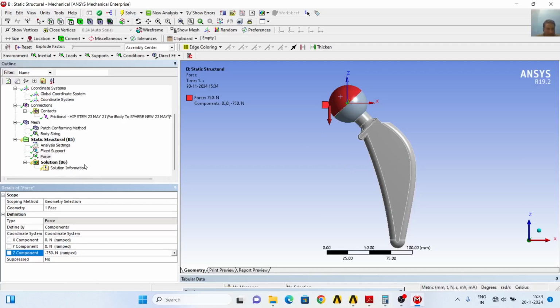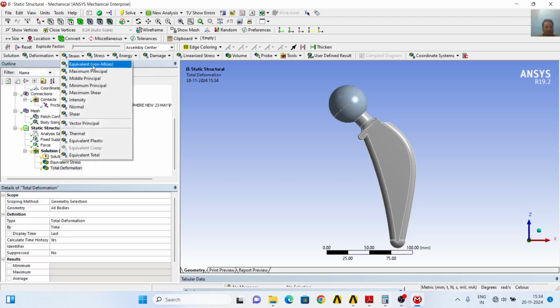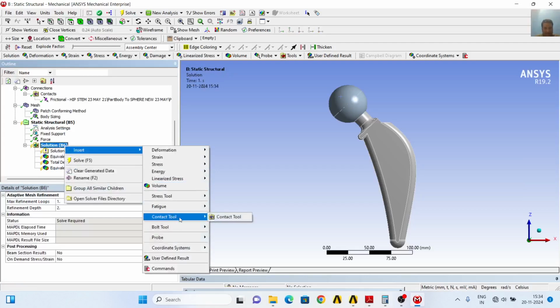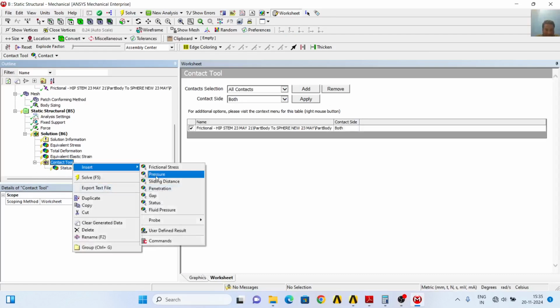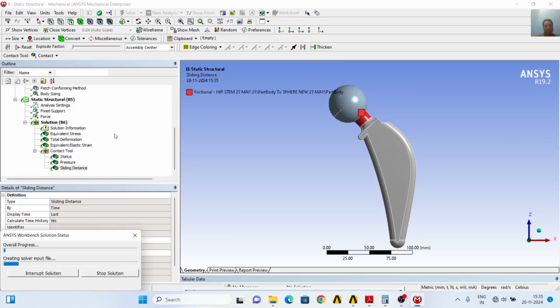Okay, and now go to solution, and you can just calculate equivalent von Mises stresses, total deformation, and equivalent von Mises strain. These are all the formalities, and not very much needed for calculating Archard wear, but you absolutely need to create here a contact tool analysis, and in this I will insert pressure, which is contact pressure, and insert sliding distance, and I will go to solve and wait for the analysis. This will take time.